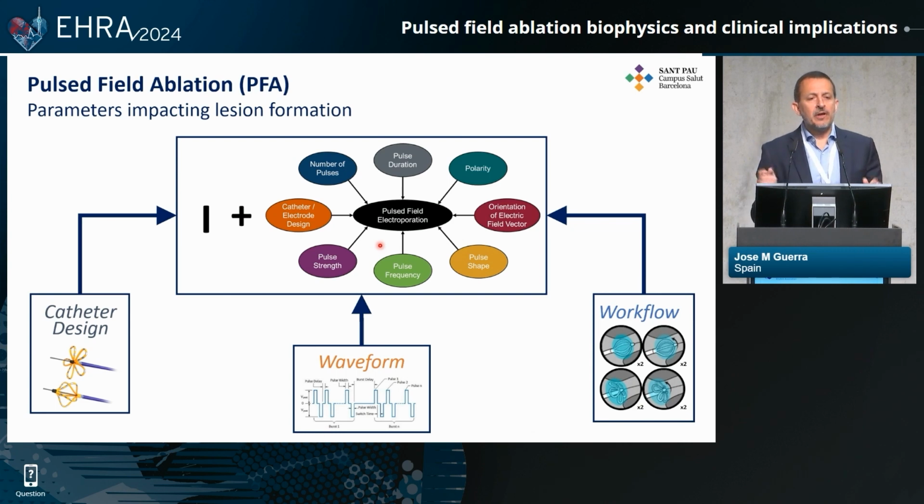We are not with radiofrequency. We have a design, we have an energy. Here we have many variables. So things are much more different than when we talk simply about radiofrequency. So with PFA, we are in a totally different scenario.